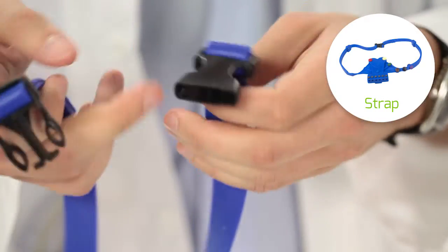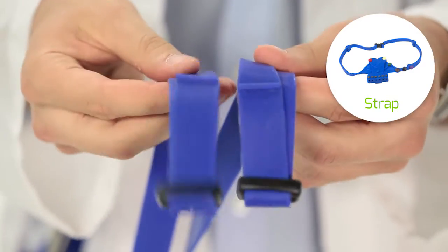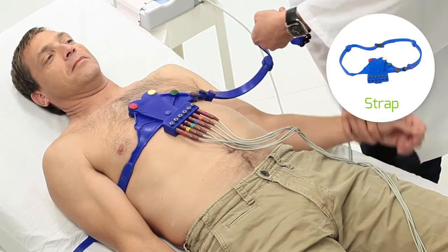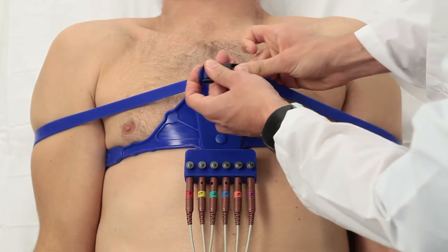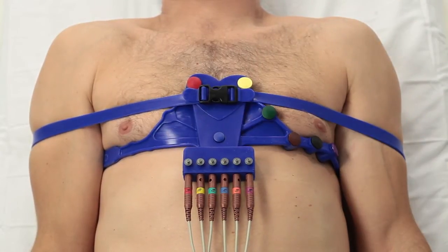If you are using the strap belt, adjust the buckle flaps in a symmetrical way. Place the straps beneath the patient's mid-arms, between elbow and shoulder, and then over the arms. Buckle the belt over V1 and V2 to improve electrode body contact. Make further adjustments to the straps if needed.